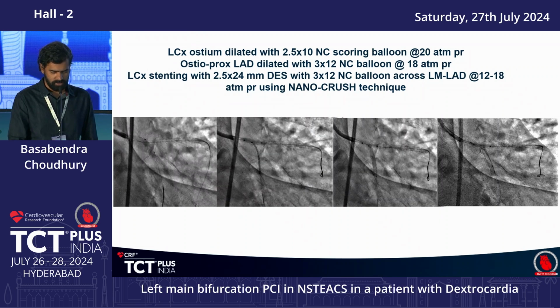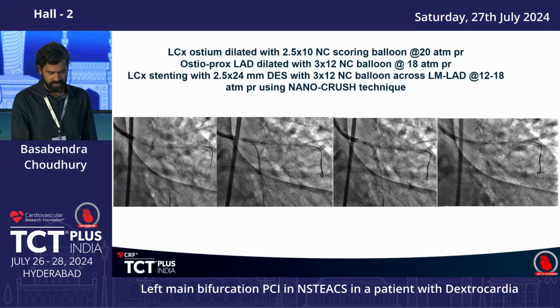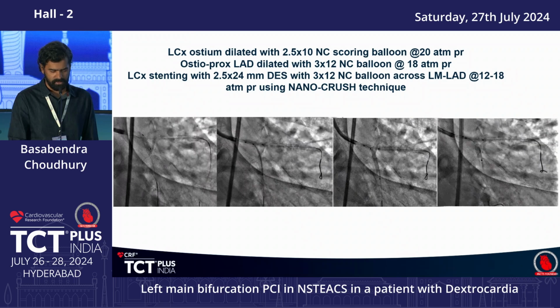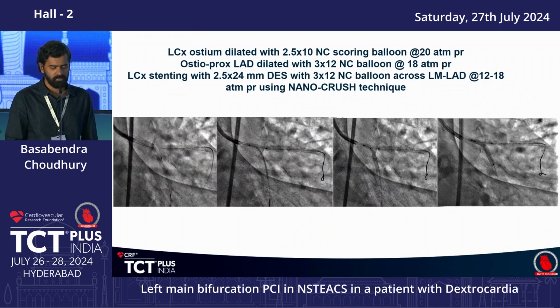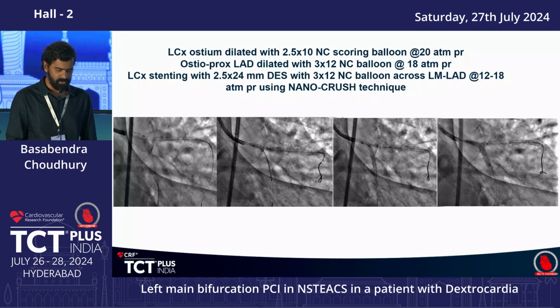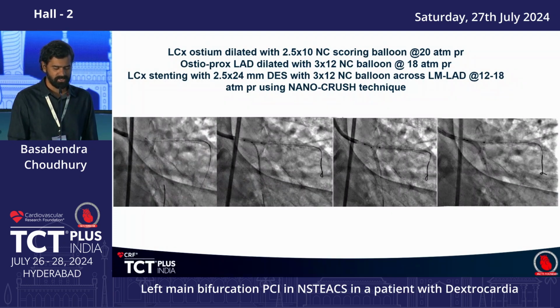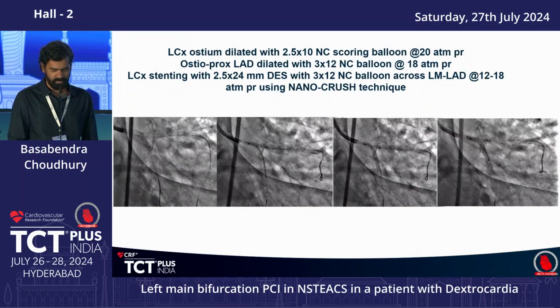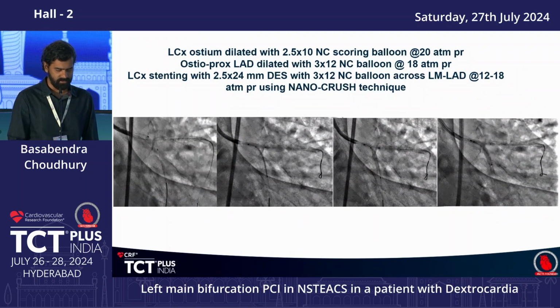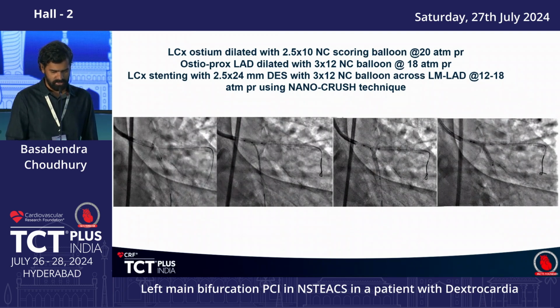This changed our plan a little. So we first decided to go for the stenting after proper bed preparation, and then go for the IVUS after we had stented and optimized the result, because the patient was still having some amount of chest pain, and the BP was not that stable. So we decided to put the stents first without wasting much time.